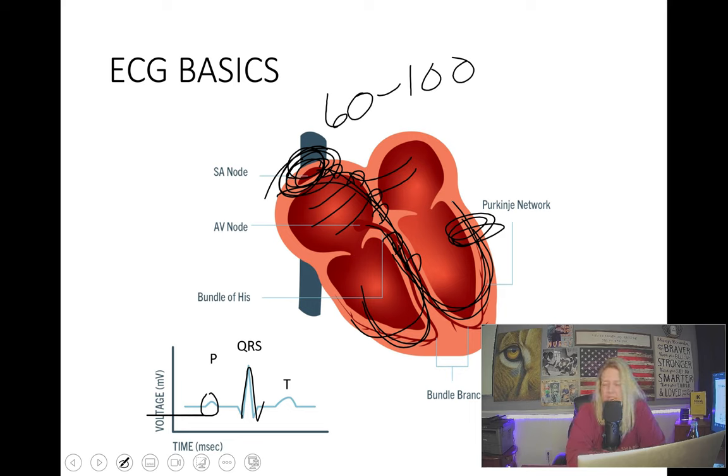I'm gonna make sure, I got a couple other questions I can ask myself, but I'm pretty sure this is a sinus rhythm. And if it's a sinus rhythm, that's a good thing. That means the sinus node is setting the pace, and that's exactly what we want. So when you see a sinus rhythm, and one of the answers says, call the healthcare provider, I go, why would I call the healthcare provider about a sinus rhythm?